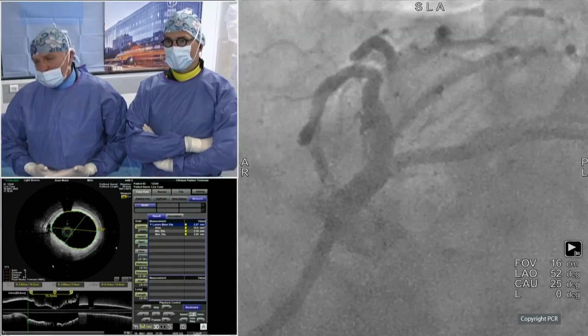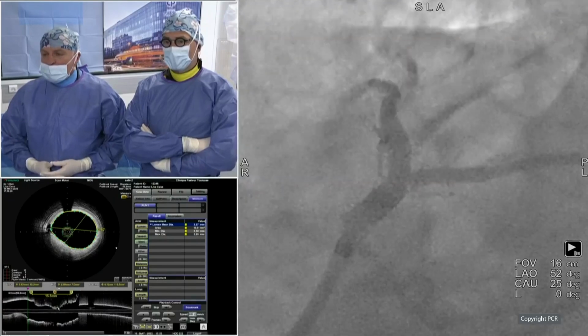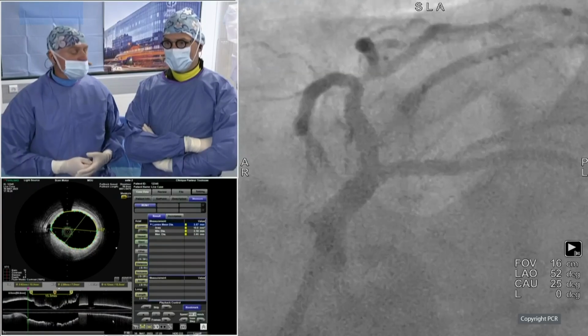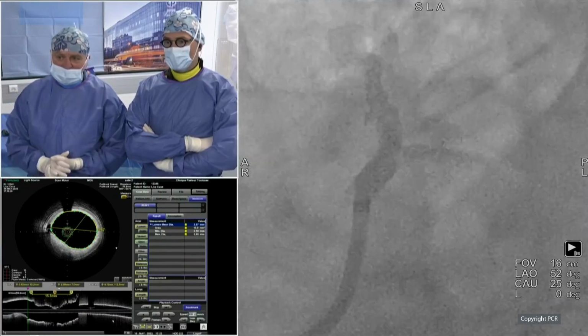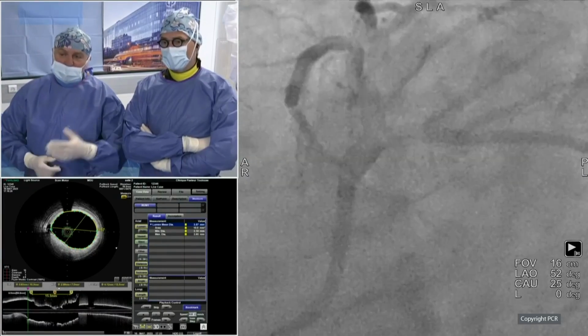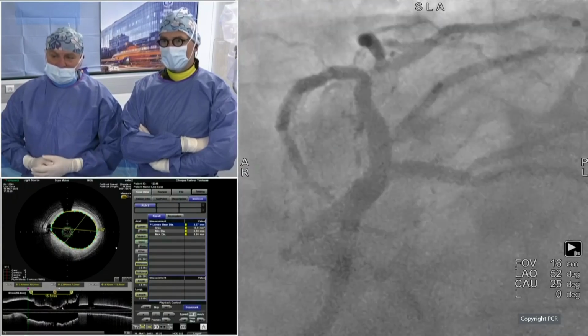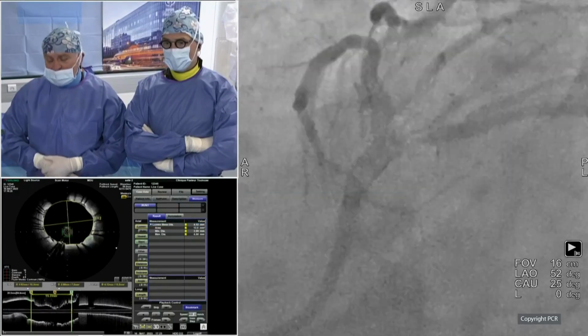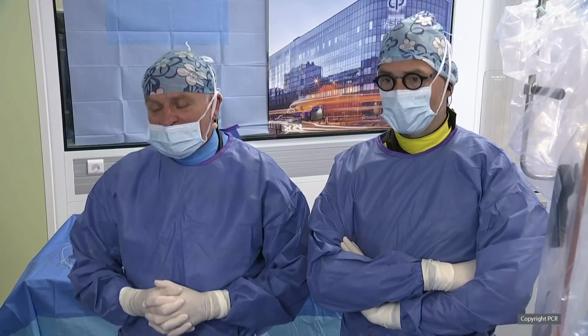It was an interesting session to do the distal left main. We tried to remain provisional, but unfortunately we did not have a very satisfying result. And then we had to deal with the compression of the left main stent, probably when we tried to cross with the circumflex stent, and we handled it with the additional stent.